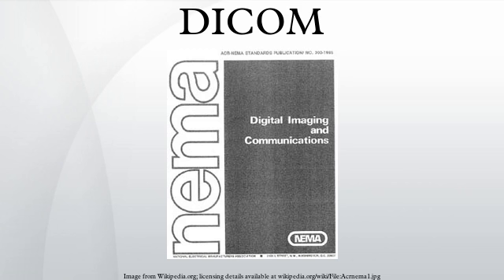Storage commitment. The DICOM storage commitment service is used to confirm that an image has been permanently stored by a device. The service class user, a modality or workstation, etc., uses the confirmation from the service class provider, an archive station for instance, to make sure that it is safe to delete the images locally.